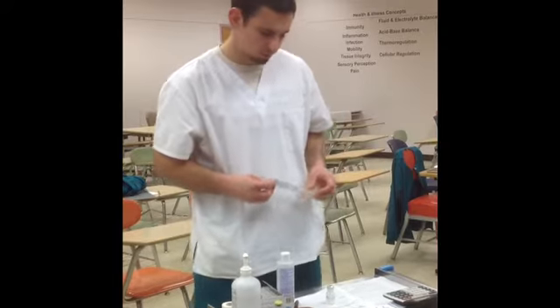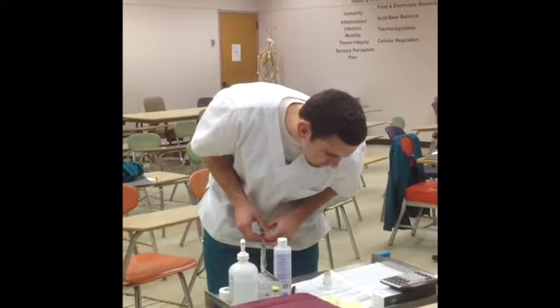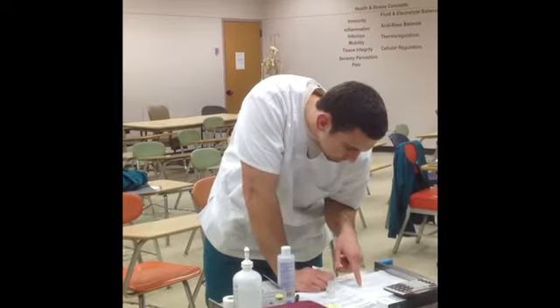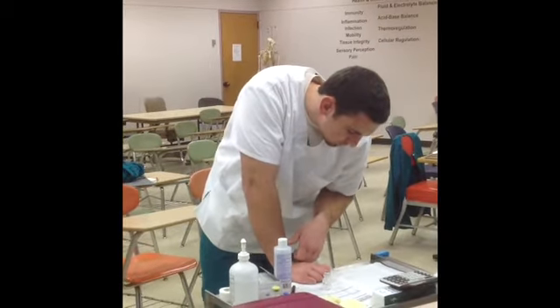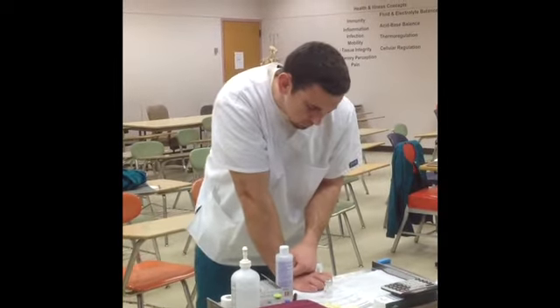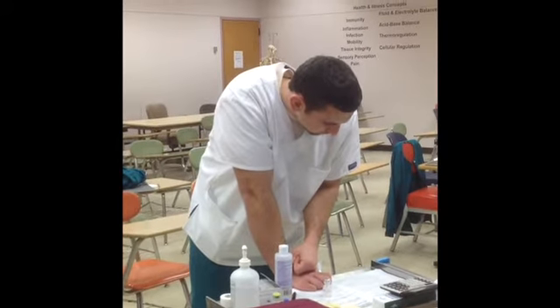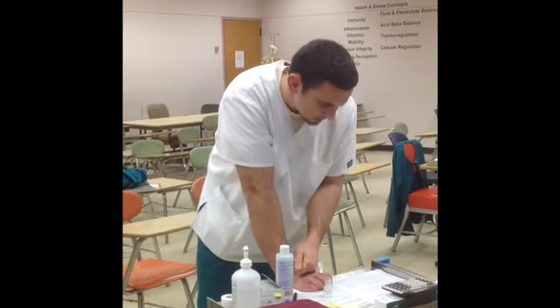Before I do that though, I might want to do another check. So we got the right name, Charles Kamang, the right med, Bacillin, the right dose, 2.4 million units, the right route is IM, and the right, what else? We got the right time, which is 9 a.m. And the right reason and response will be later.